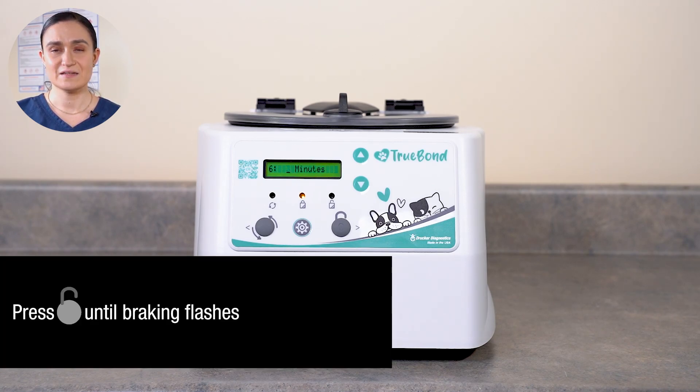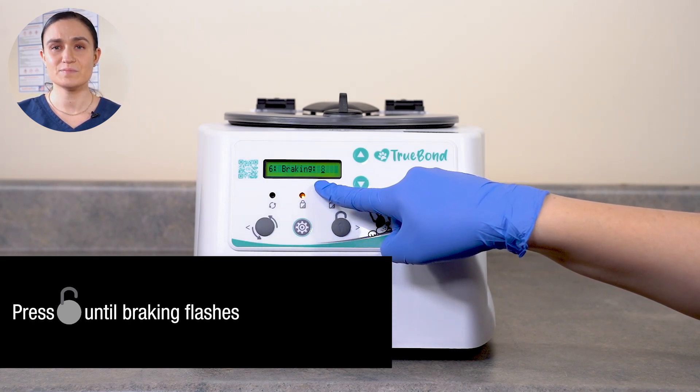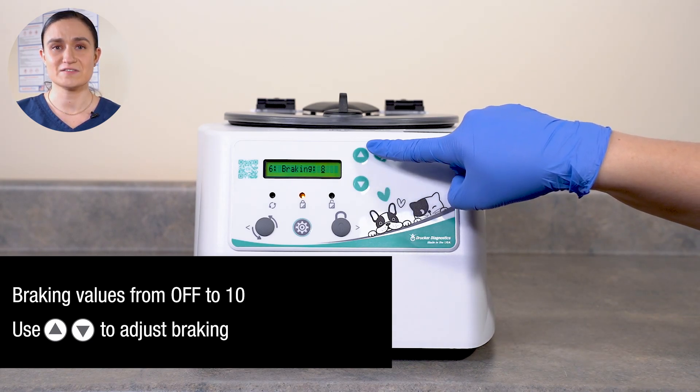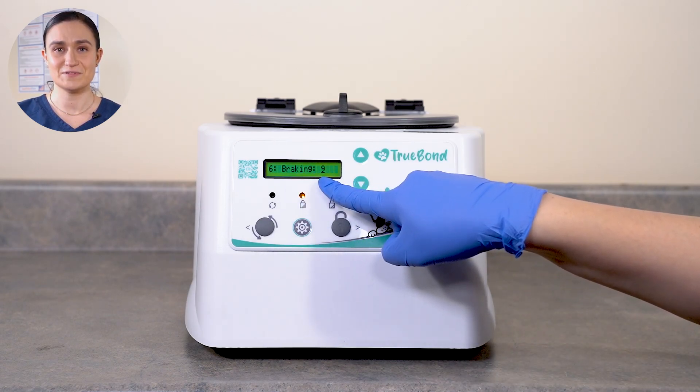Once your desired time is set, press Stop Unlock again. You'll see the word Braking and a number or the word Off. This indicates you are now editing braking. The braking setting controls whether or not braking is applied to slow the centrifuge rotor down after it has finished spinning your samples. Brake values can be set anywhere from Off, meaning no braking, to 10, which is maximum braking. Use the up and down arrow buttons next to the screen to adjust the braking.